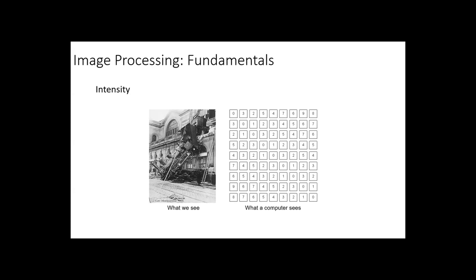This is the temporal lobe, this is the frontal lobe, the parietal lobe. We give color to each pixel, right? So we need something like object detection or a region segmentation algorithm. We're going to go through this just briefly.